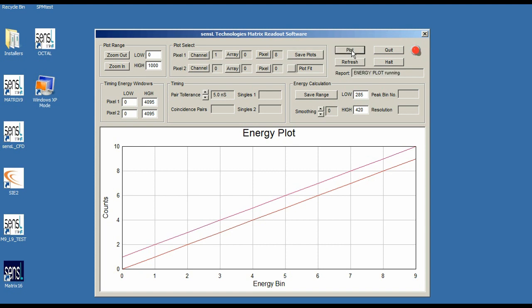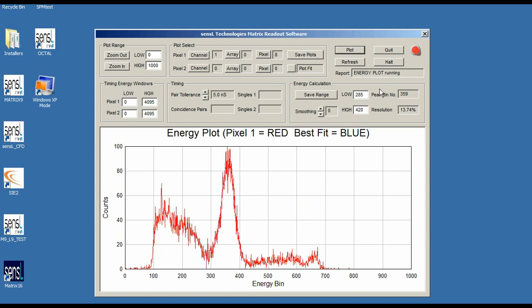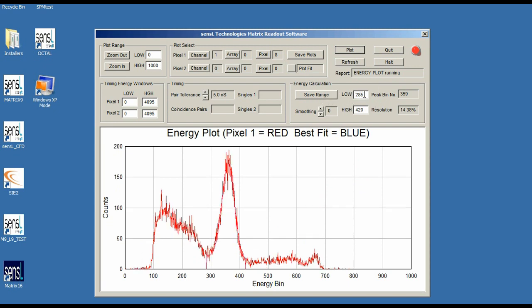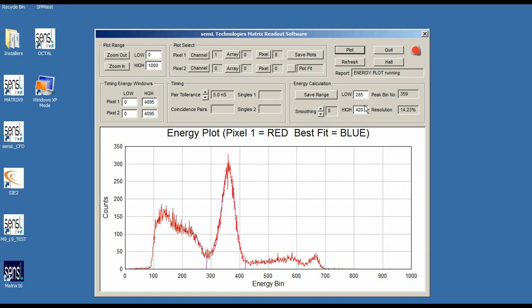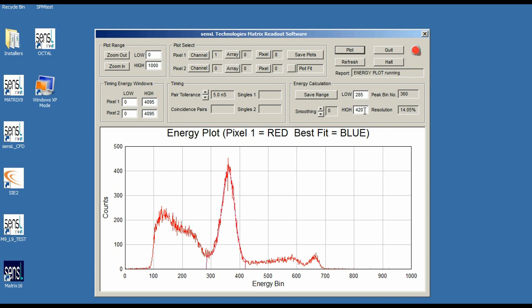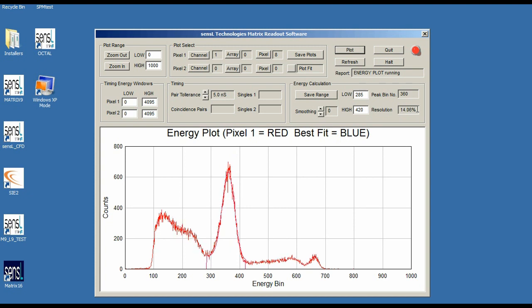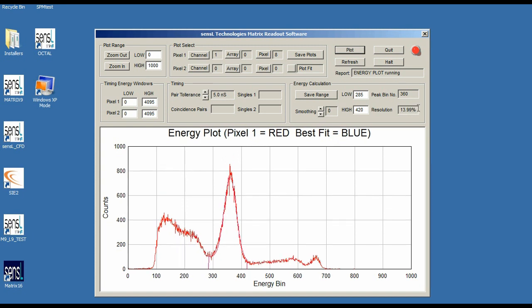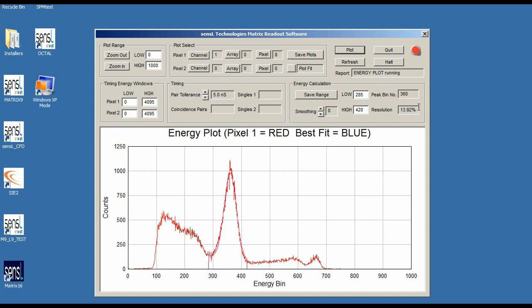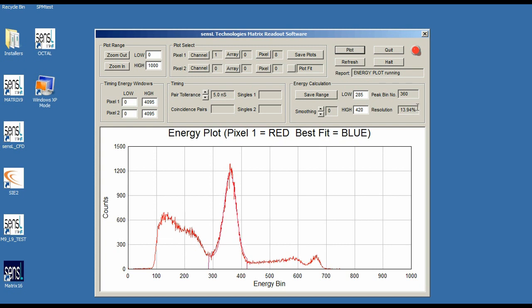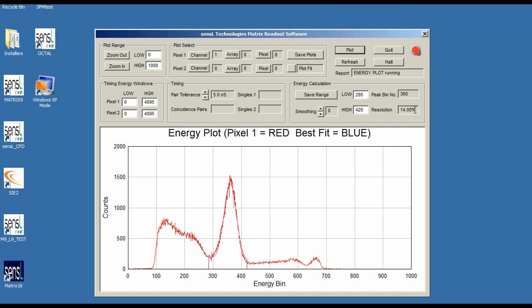The energy plot is running. The fit range 285 to 420 was left from the previous setup, and that looks fine for this measurement. It's showing about 13.9, 13.99 — hovering around 14% energy resolution from a totally different array and totally different pixel. We haven't changed the bias setting or the threshold setting on the pixel or array — everything is at exactly the same settings.